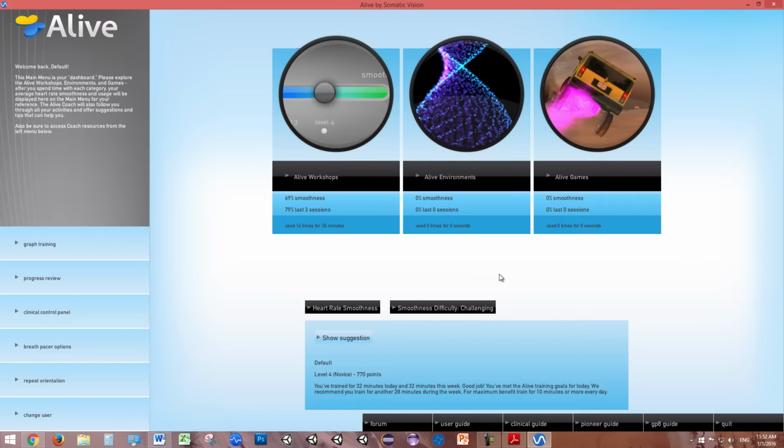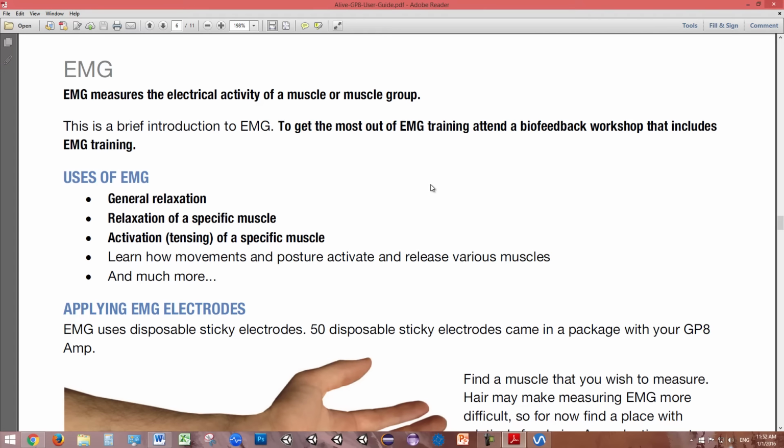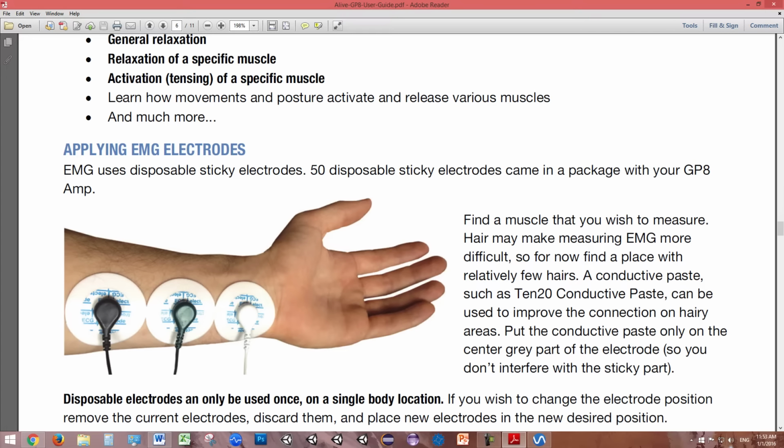Now, let's get familiar with training muscle tension using EMG. If you are not trained to do EMG feedback, I strongly recommend you read the Alive GP8 user guide section on EMG training. Begin by attaching 3 disposable sticky electrodes to your arm as shown. The same sticky electrodes are used for ECG and EMG training, so your electrodes are probably labeled ECG electrodes.